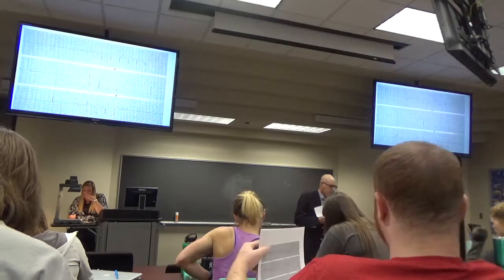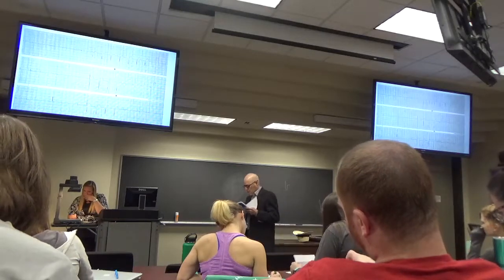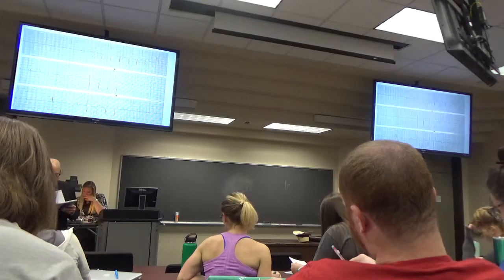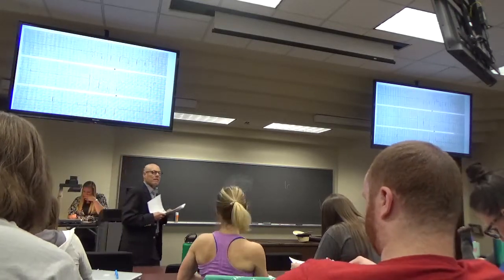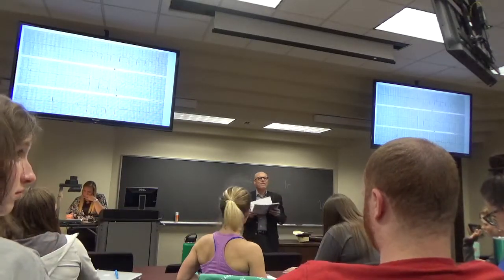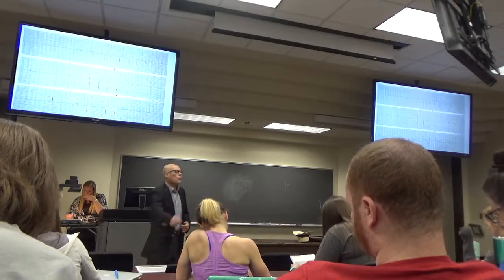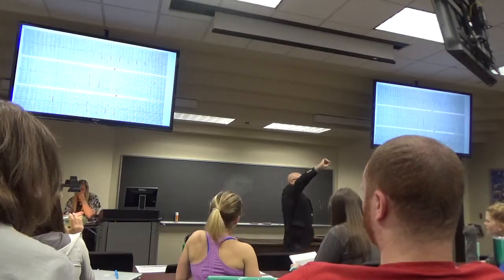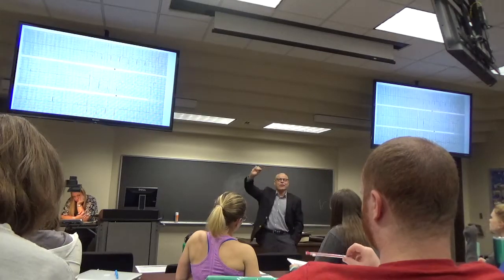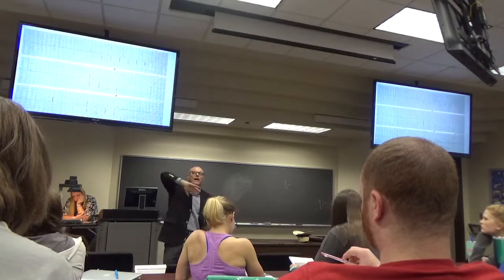Okay? And so that leaves your anterior infarction. So you've got this V1, V2, V3, V4 anteroseptal infarct. What's the age of the infarct? Acute. How many said old? How many said acute? Why did you say acute? Elevated ST segment. If you're worried about an ST segment that's elevated off the baseline as an acute injury pattern, it's acute. That's always an acute finding, okay?